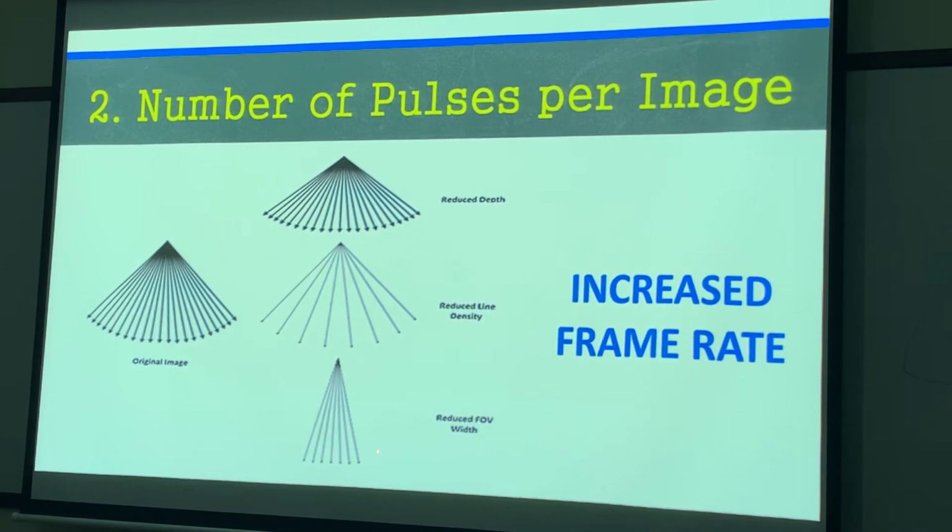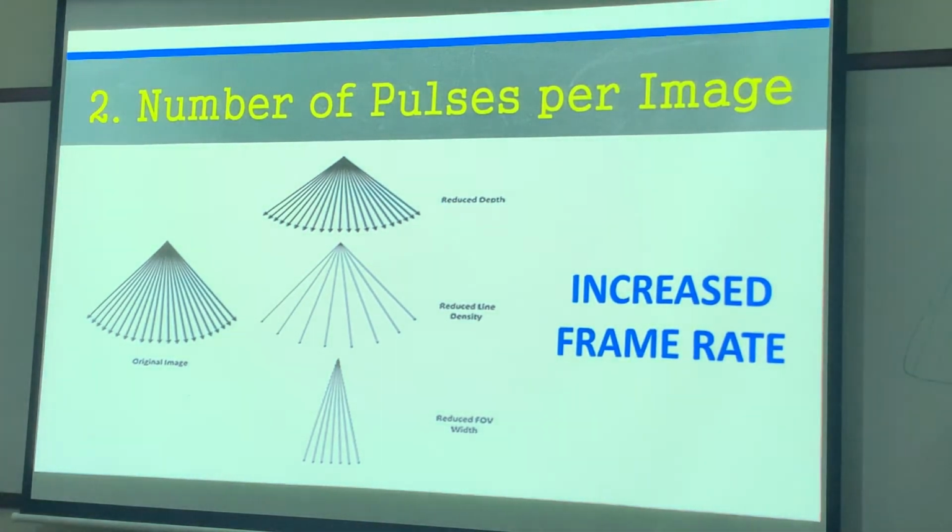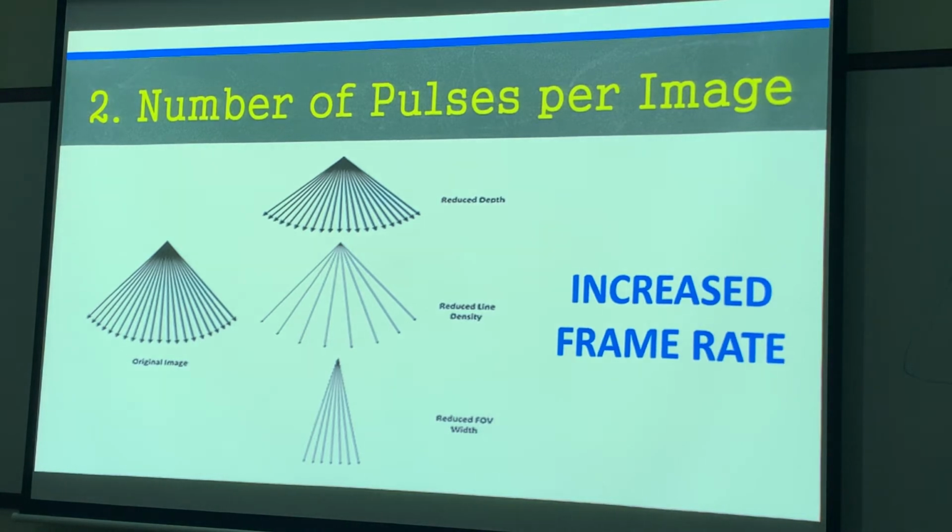Remember, the number of focal points affects lateral resolution. When we're talking about line density, we're talking about spatial and detail resolution. When we're talking about sector width, we're not talking about the quality of the image. We're only talking about the speed at which it's acquired, the time.